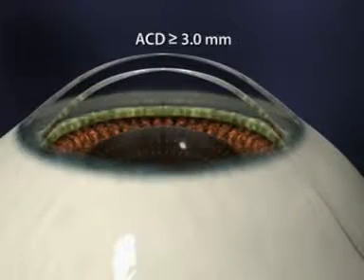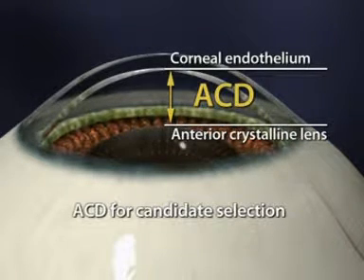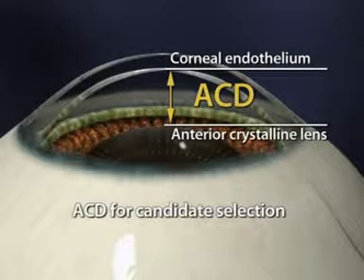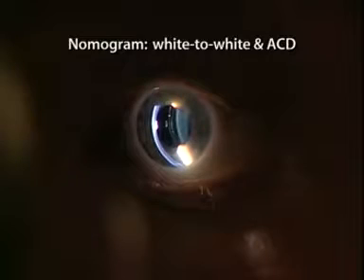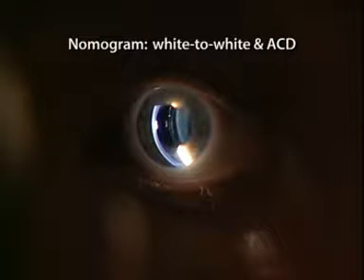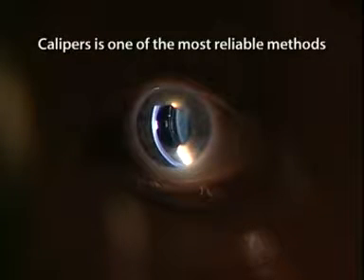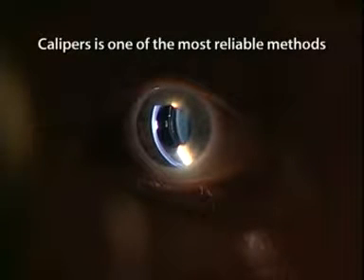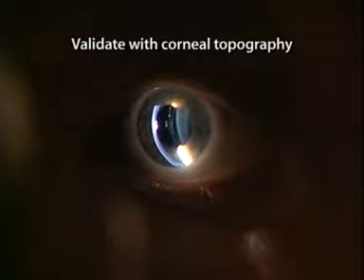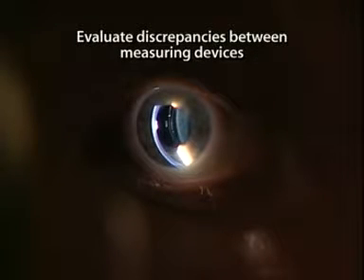A minimum ACD of 3 millimeters is required. For the purpose of candidate selection, the ACD is defined as the distance from the corneal endothelium to the anterior lens capsule. To determine the ICL length, a nomogram using a combination of white to white and ACD is utilized. The measurement of white to white is critical. Physical measurement with calipers is one of the most reliable methods, and should be validated with a corneal topography unit such as Orbscan.